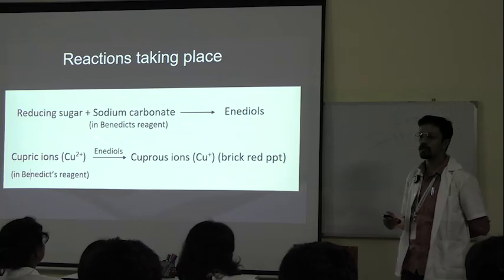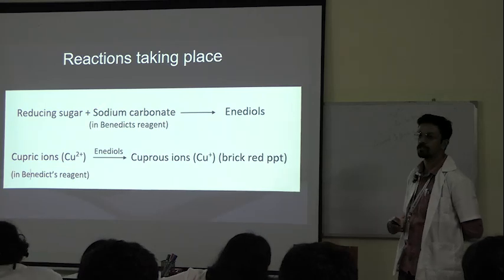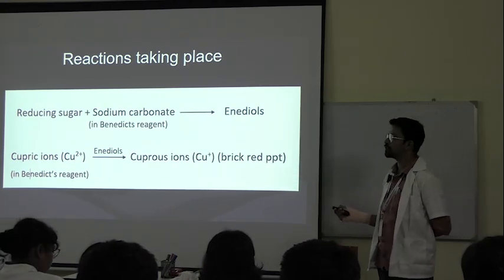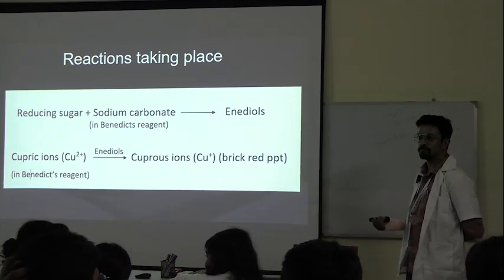What is the function of sodium carbonate? It's a reagent. I know it's a product of the reagent. What is the function of sodium carbonate? No, it's not reducing sodium. Making it alkaline. It is making the medium alkaline.